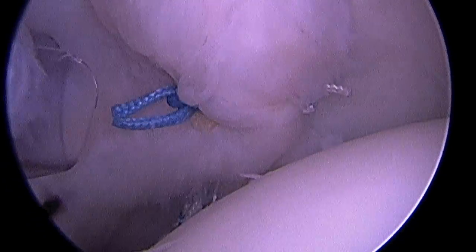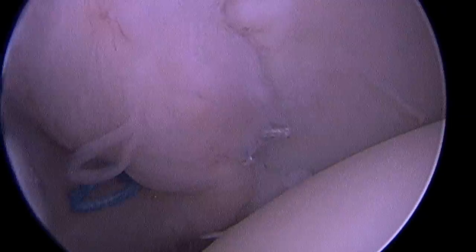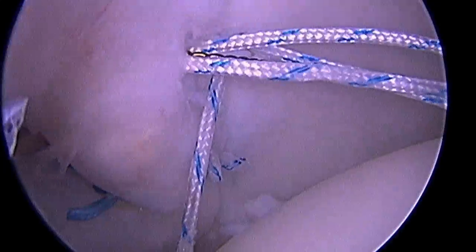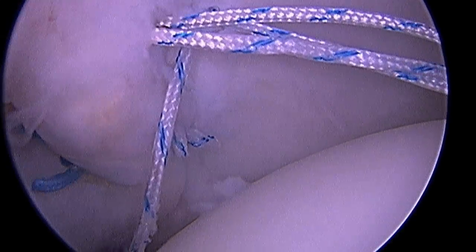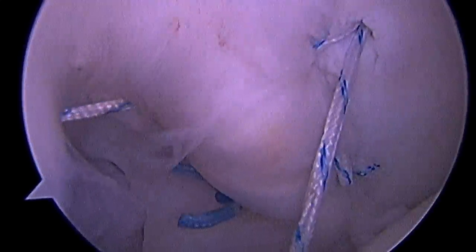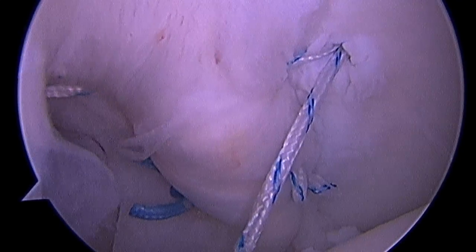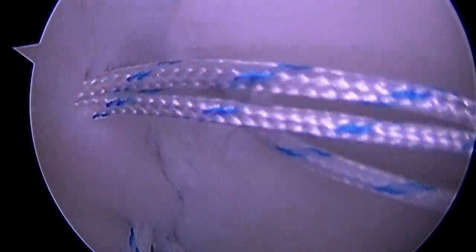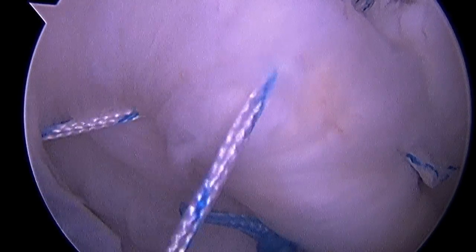Here we've tied down the first four anchors, and you can see we're starting to restore that bumper effect of the labrum and posterior ligaments. There's the last anchor going into place, and we're passing each arm of that suture through the labrum and the ligament once again. I'll take a very small bite of tissue on this last pass, because really it's the tissue between the two sutures that tightens when we tie down the knot, as you see there.